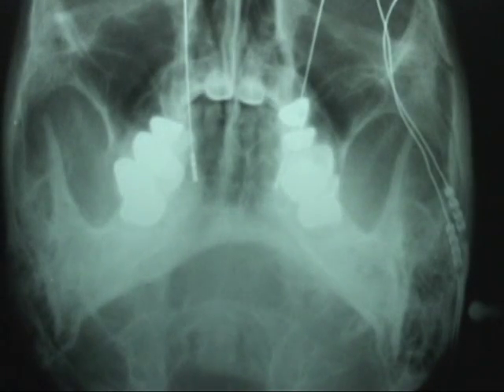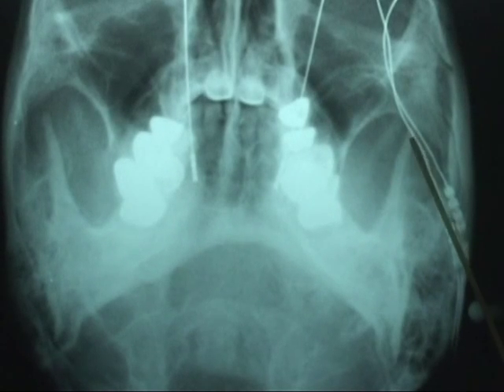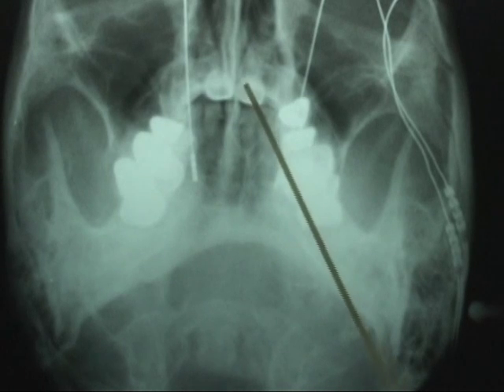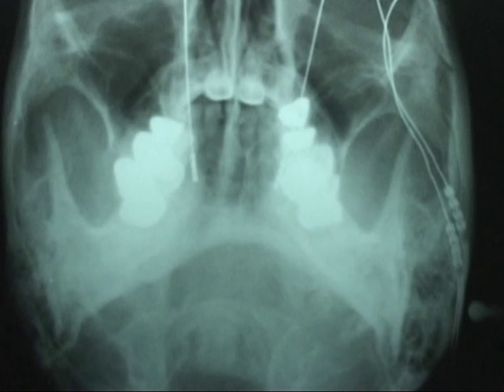This is this patient's submental vertex X-ray. It again shows the wires of the deep brain stimulator here and running down the side of her head, down her neck. It also indicates that she cannot extend her head posteriorly, because if she had normal extension of the head, the upper teeth right here would be at the top of the film, right up here. But this is the patient's best effort at extending her head, and you can tell just from the X-ray that she doesn't have normal extension.